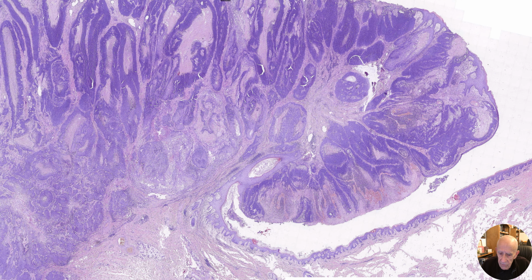And then this is a lovely one that Antonina Kalmykova shared with me, and I think it came from, well, it is extraocular. I'm not quite sure where the site was. Perhaps it was from the abdomen. Anyway, it's a gigantic tumor, absolutely gigantic, and you can see at the top in the right-hand quadrant that it's ulcerated, and there's lots and lots of necrosis.